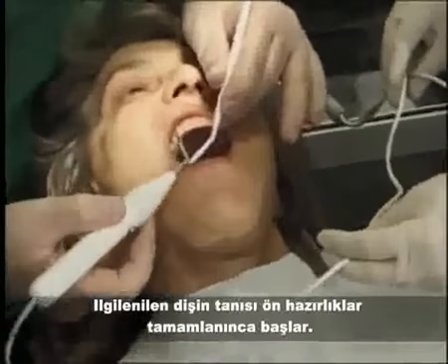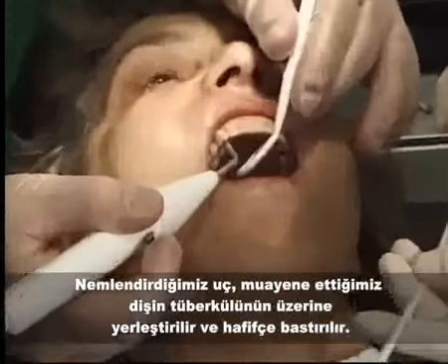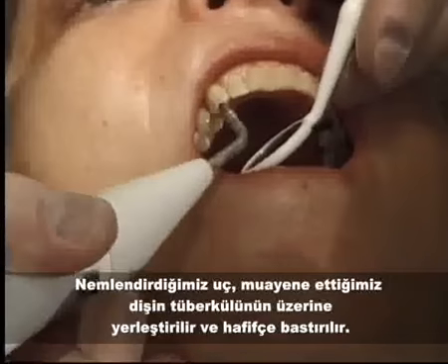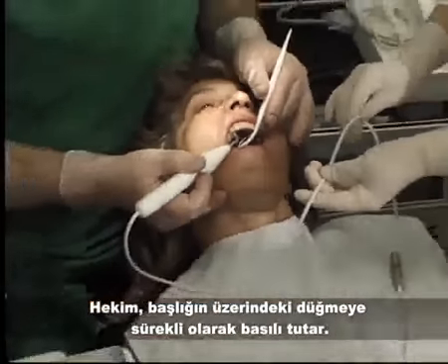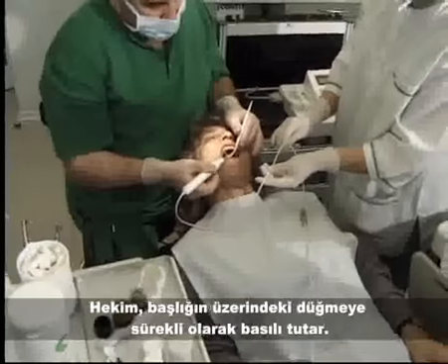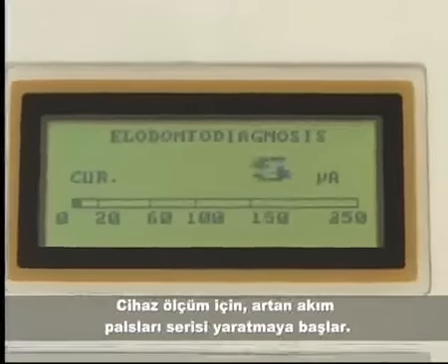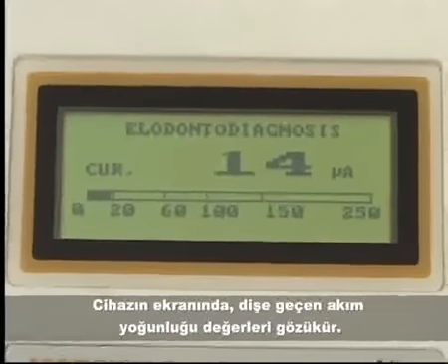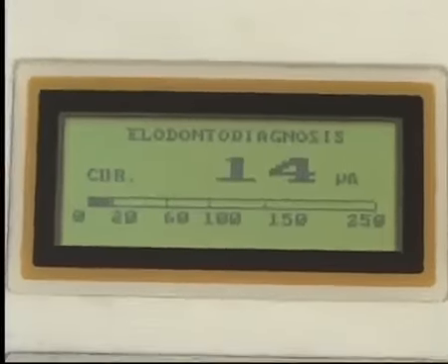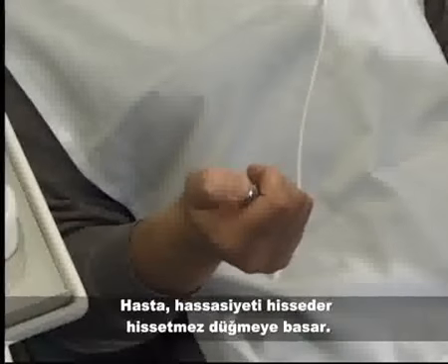The tip for examination is placed upon the tubercle of the examined tooth and is then lightly pressed. The dentist keeps pushing the button located on the appliance handle. The device begins to generate a series of increasing current impulses for measurement. On the device display are indicated the values of the current intensity passed through the tooth. The patient pushes the button at the first irritation sensation.